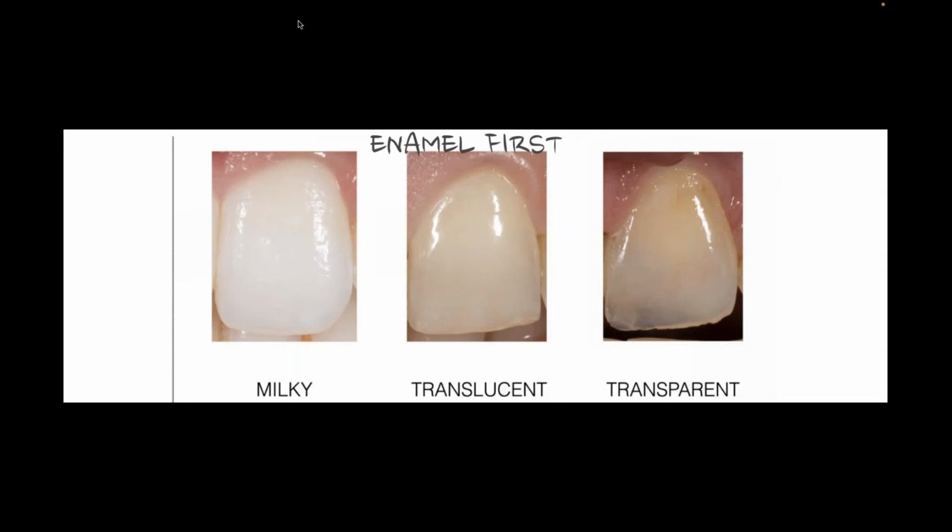I know when I ask the question how people take shades, all the hands go up and everybody has a way they do it. The number one answer I hear all the time is value. I pick the value first. I want to know what the value of the tooth is. The value is the most important. It seems like that's kind of drummed into our heads.